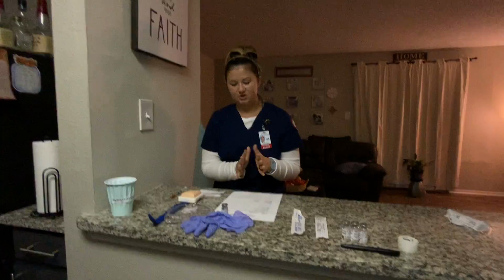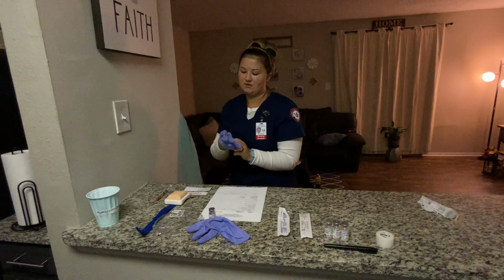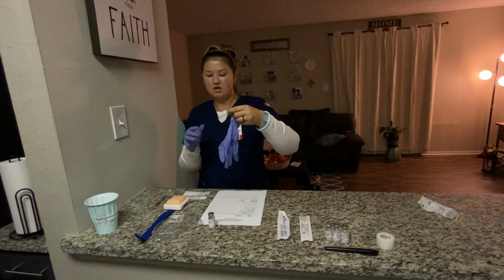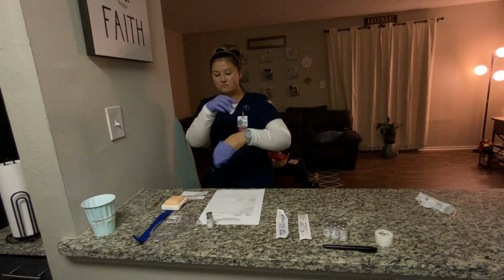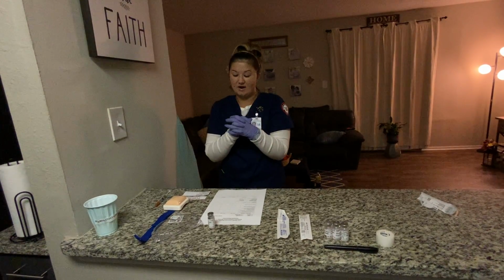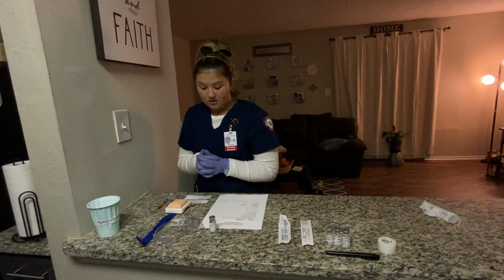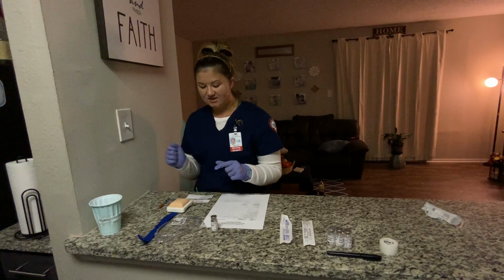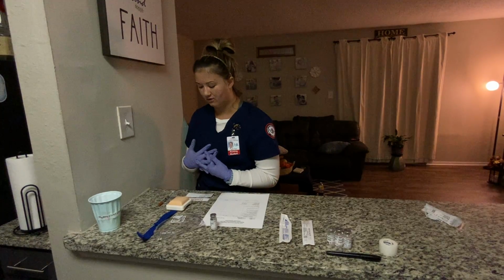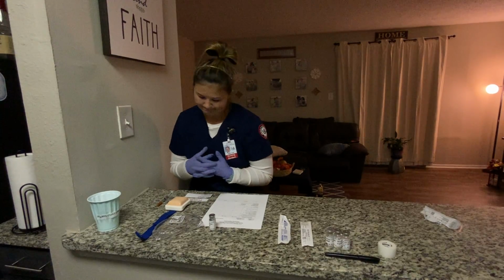So now that I have done my third check of rights, I'm going to don my gloves and goggles. While doing this, I'm going to note that I'm going to be giving this subcutaneous injection in the abdomen, not going any higher than the costal margins, any lower than the pubic area. I'm not going to go past each side, past the anterior superior iliac spine, and I'm going to say 2 inches around the umbilical area. And also I'm going to pinch 1 inch of the skin, give it at a 45-degree angle, or if I could pinch 2 inches of the skin, I could give it at a 90-degree angle. And due to the medication in the form, I'm not going to be aspirating for blood.